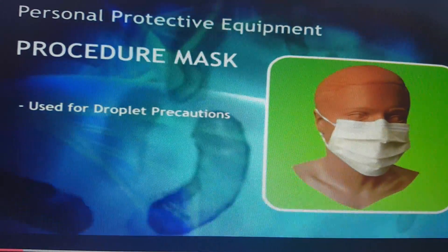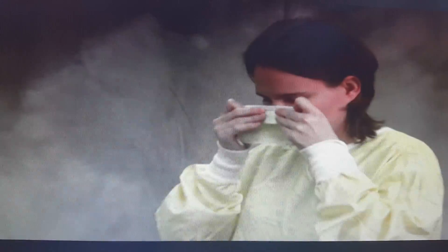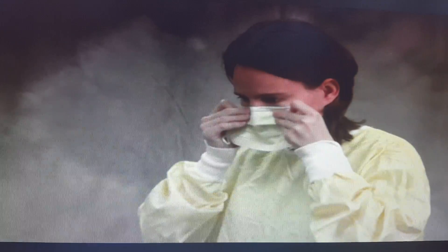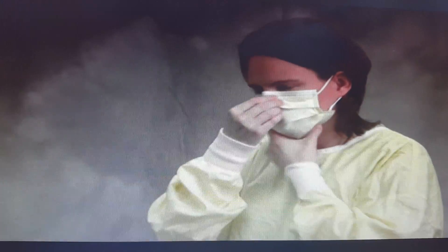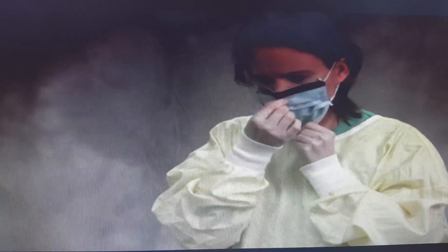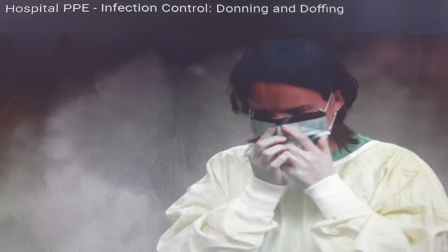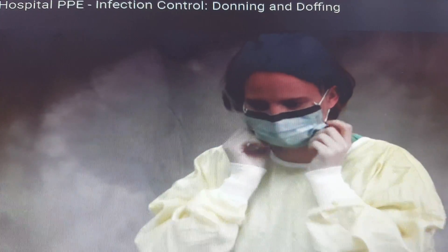Wear a surgical mask when caring for patients with droplet infection, such as influenza patients with more secretions. To wear the surgical mask, place the metal strip on your nose and press it so it is closed against your nose. Sometimes we wear the mask with a face shield if there are splashes — for example, during dental procedures — to protect our eyes from blood droplets or splashes during the procedure.